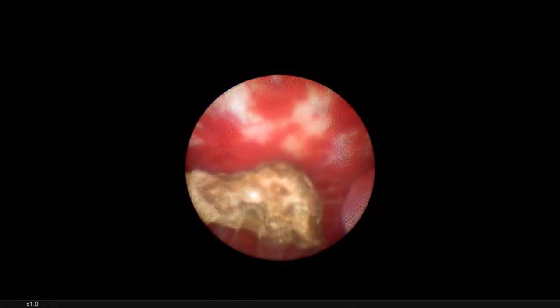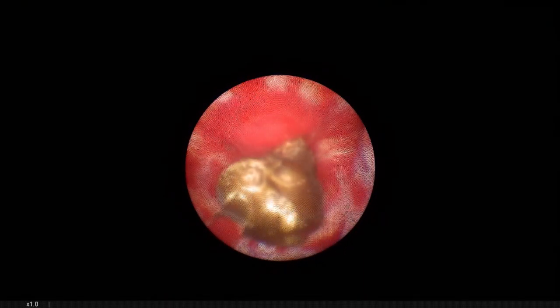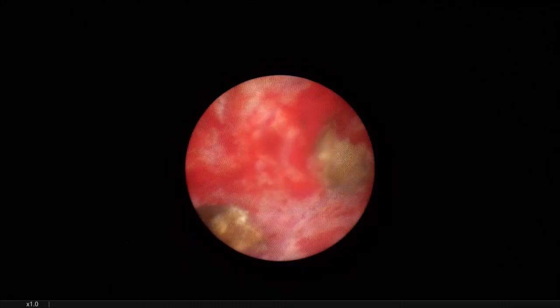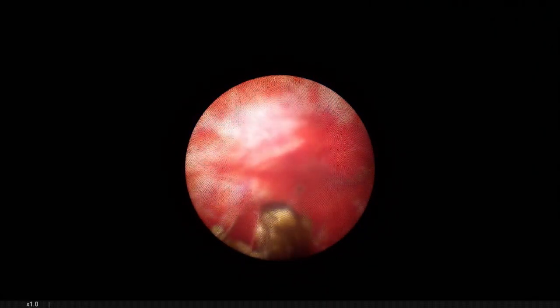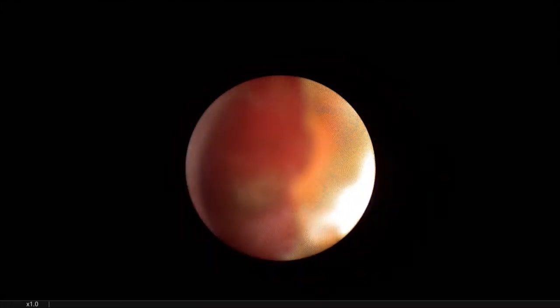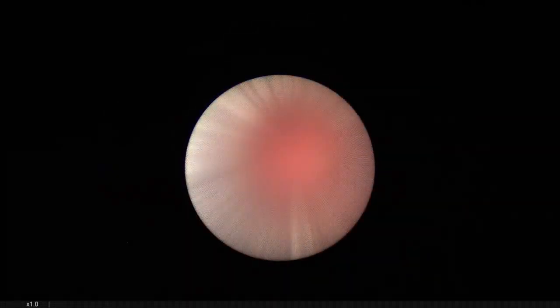And used to put a double stent or a nephrostomy too. Tubeless? No, no. Or my suggestion, nephrostomy. Nephrostomy? Yeah. Okay. You have nephrostomy? Yes, we have. The thread to fix it. Next stone is coming. Three stones. Yes, we see it clearly that the stones are going outside by the vacuum cleaner effect.